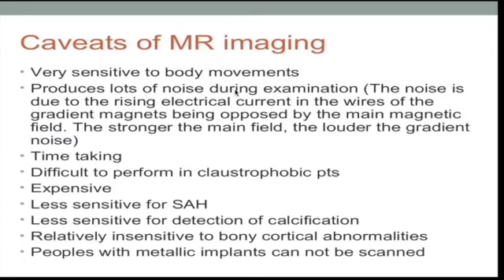And it produces a lot of noise during the examination. And here by the word noise, we don't mean noise in the image, because I know a lot of you using photo editing applications would think this is referring to the image. No, it just means noise in the literal sense. It's just very loud, okay? It takes a lot of time.